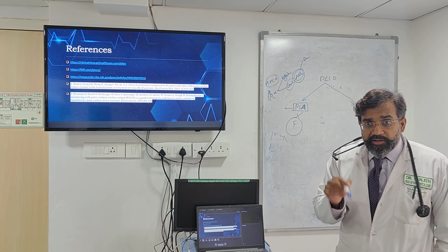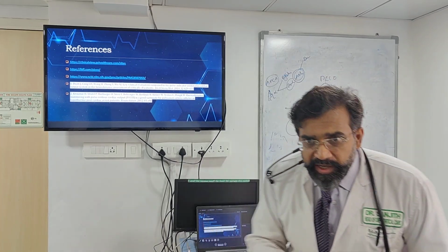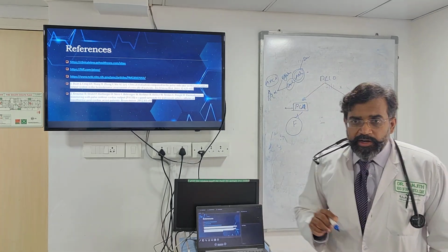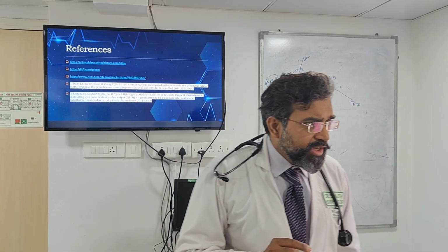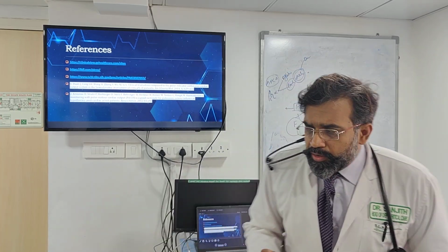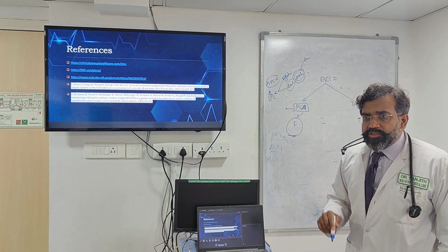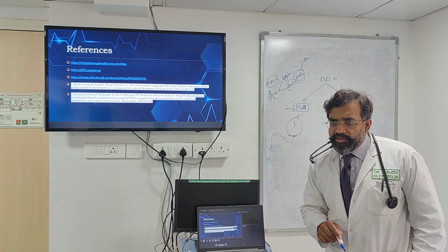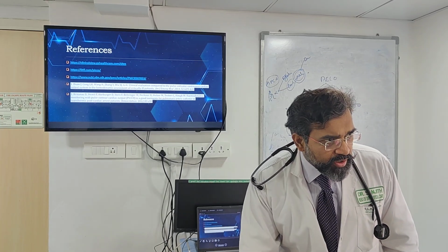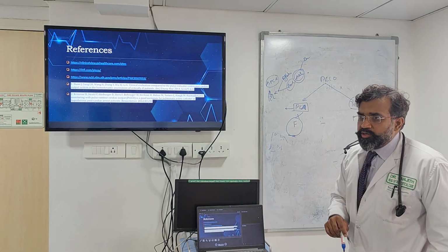That's why what I'm trying to drive home is, when you're actually going to use Picco, I need to enter the age, gender, height properly. If I don't put the age, gender, height properly, the contour analysis will not be right. Number one. But this doesn't come immediately. In Picco monitors, you need to standardize and tell the monitor what is standard. To understand what is standard cardiac output monitoring, the second technology that is used is transpulmonary thermodilution.